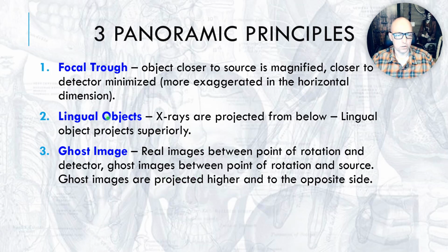Again, that kind of relates to principle 2. X-rays coming from below, so that it comes all the way from the other side, it's projected higher on the other side and to the opposite side. One way to remember that is ghosts float. So ghost images should be projected higher when you see them on the other side.